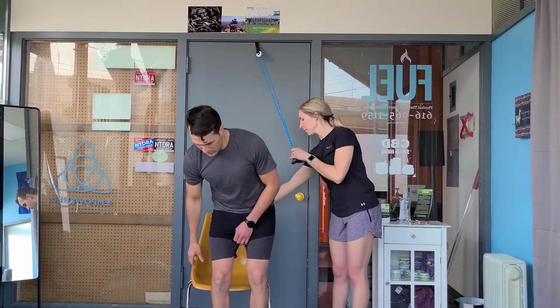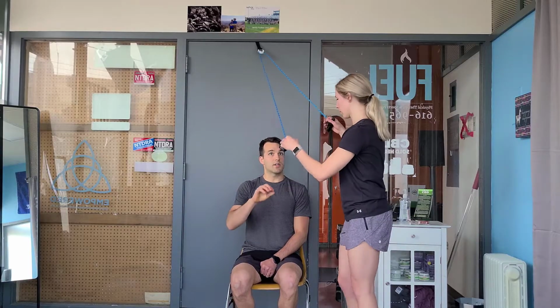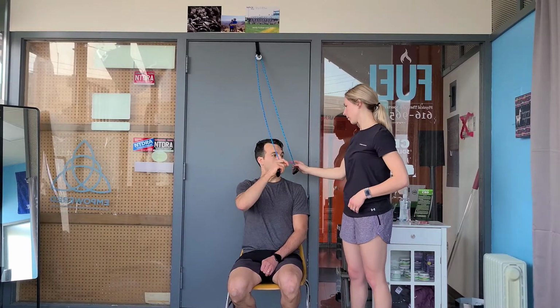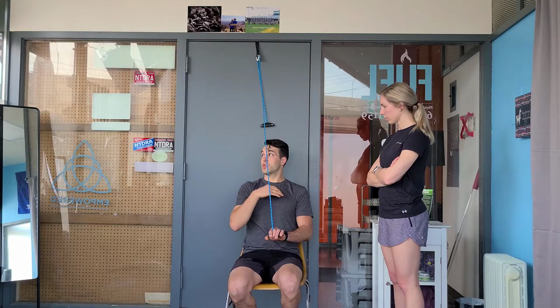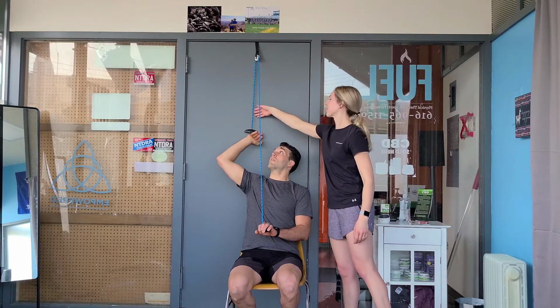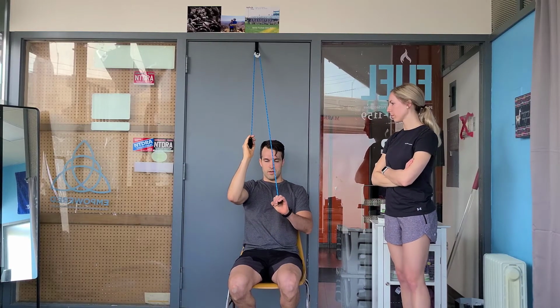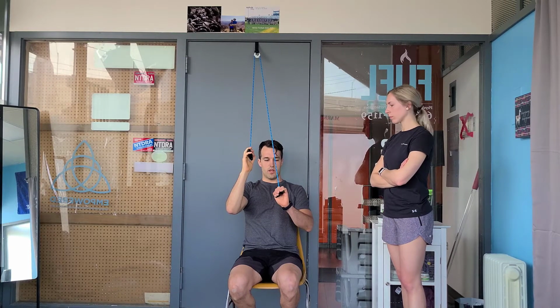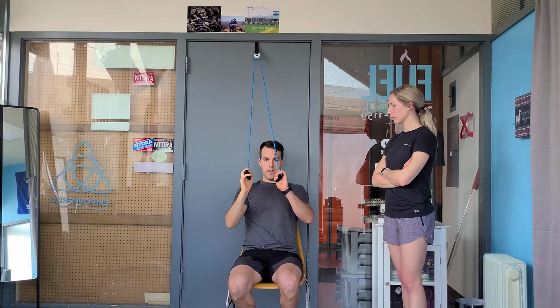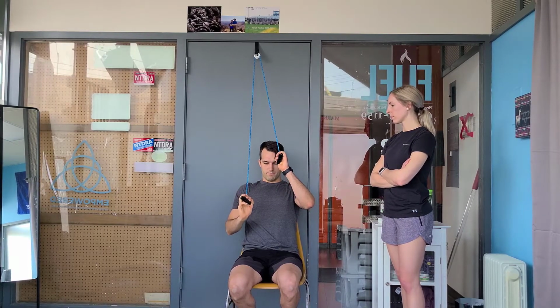And you just take a chair here, and sometimes I'll stand even and do the exercise, but a lot of times I'll have my patients sit, and I'm going to sit and show you. So with this, I want to bring this down to my hand, so it's my left shoulder that's going there, and then I'm going to grab the other one, and I'm simply going to pull. This hand, my left hand right here, is not doing any of the work, it's just along for the ride, and I'm pulling the other arm down to pull this one up.